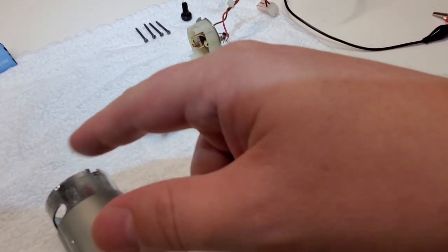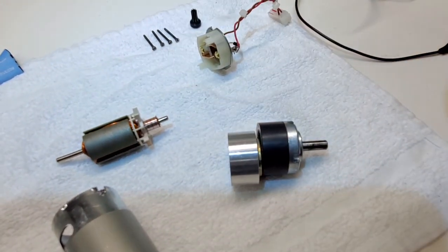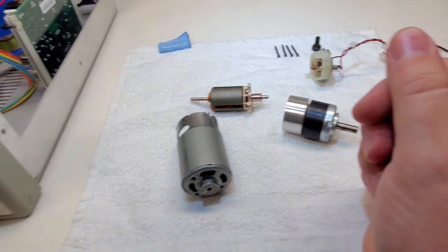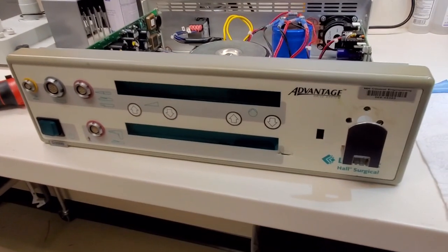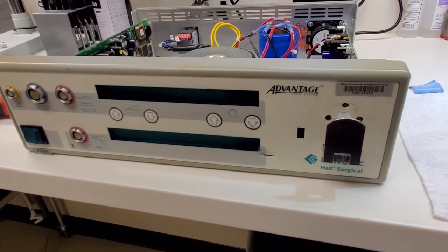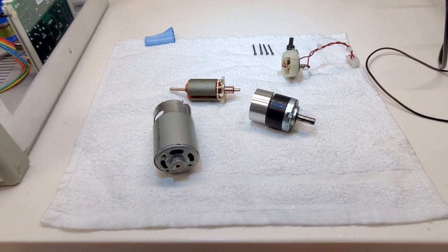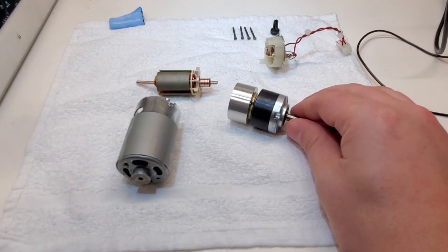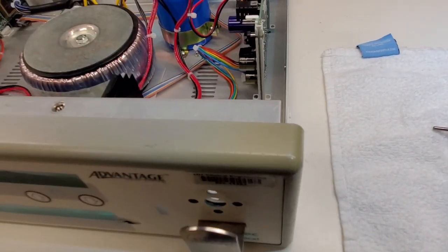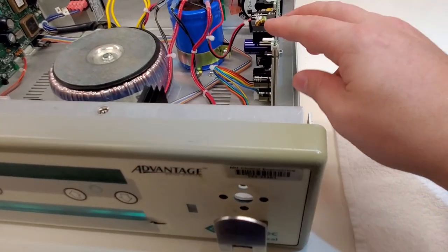Who's to say, you know, that debris probably got down inside your rotor right here. I haven't ohmed any of it out. It doesn't really matter. This whole unit is sold as a part. And unfortunately, this manufacturer, they still support it, luckily, and they're not very expensive. It's only like $1,400 to change out the whole entire unit for replacement. But unfortunately, this motor is going to cost me $1,400. Absolutely ridiculous. Since they have the Molex style connectors, it's really easy to change it out. I don't understand why they wouldn't just sell you the part, especially when it just plugs in right here.